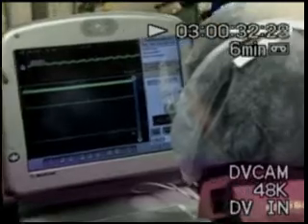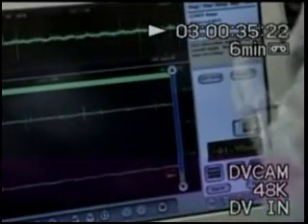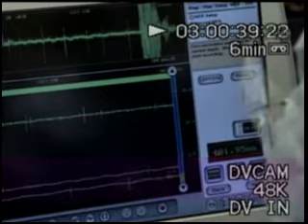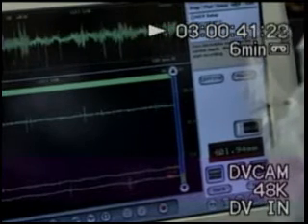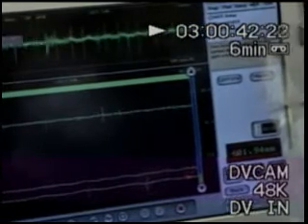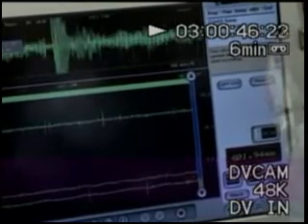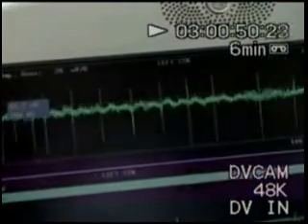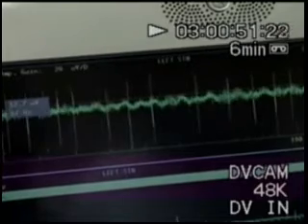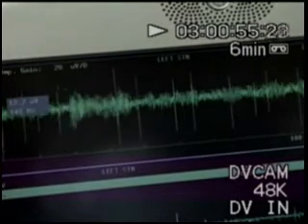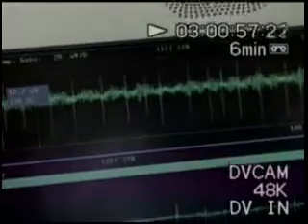And as a general rule, as we approach the target, those spikes — those little vertical lines that you see — these are brain cells discharging. And I use that form and the sound that it makes to know if we are in the correct place, which is a critical part to ensure the surgical success.